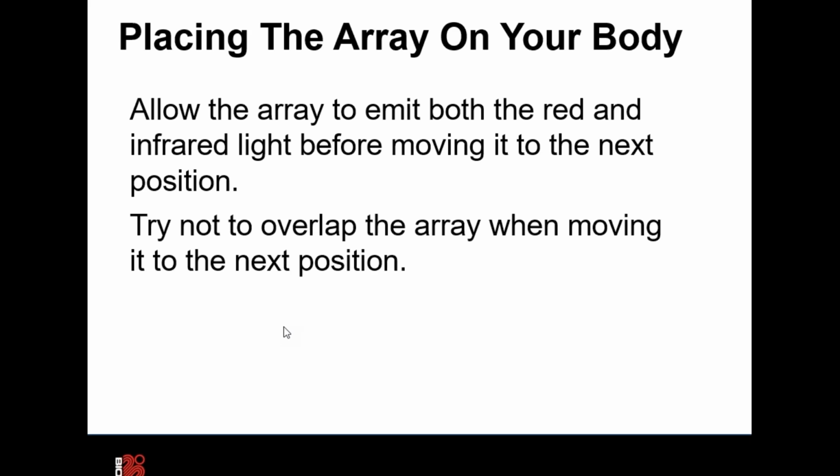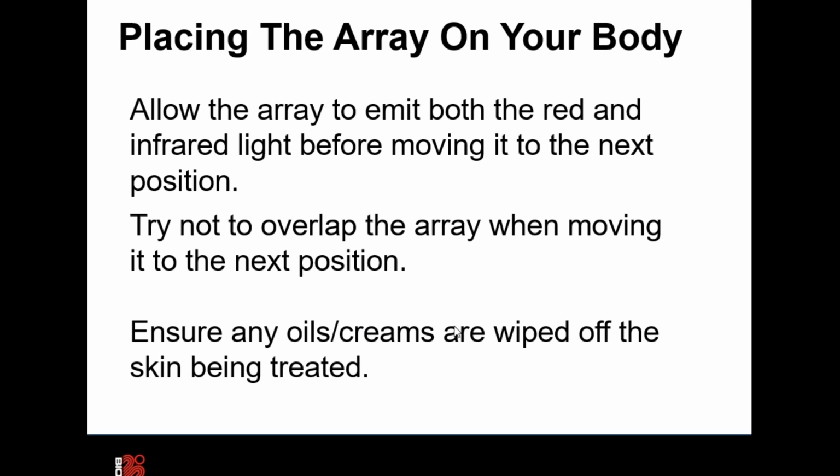it's emitting energy. Try not to overlap the array excessively when you move it to the next position, and ensure that any oils, creams, or anything that you have on the skin is removed or wiped off before you're treating that area.